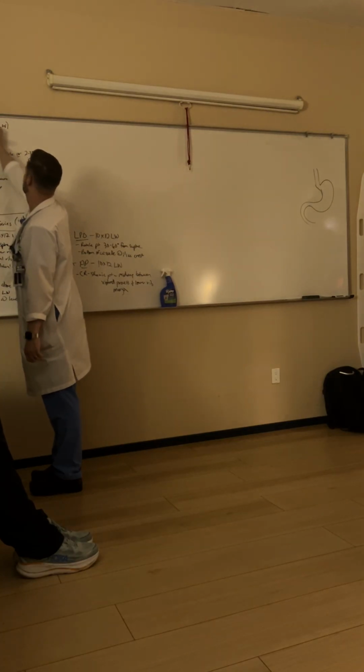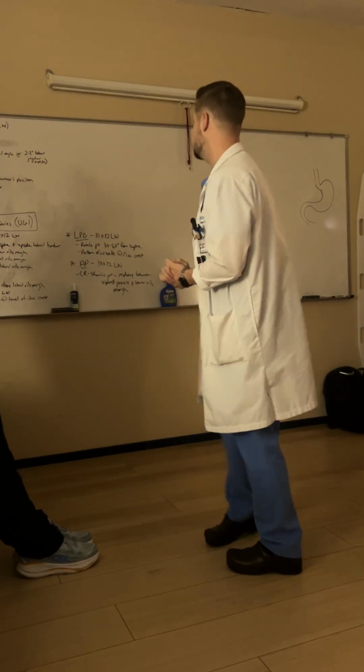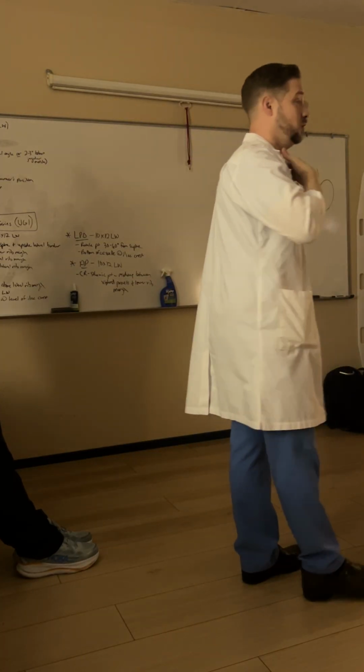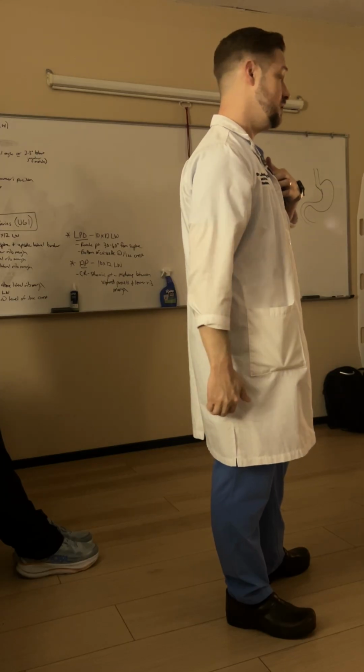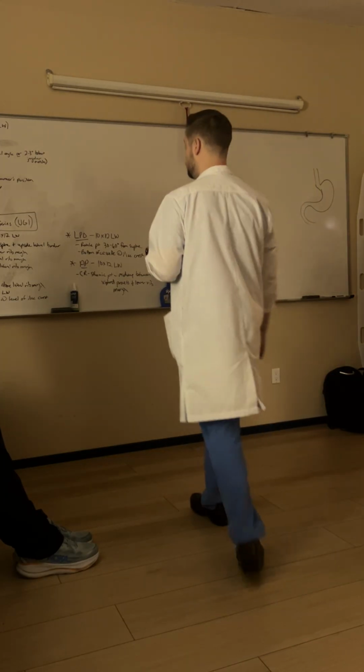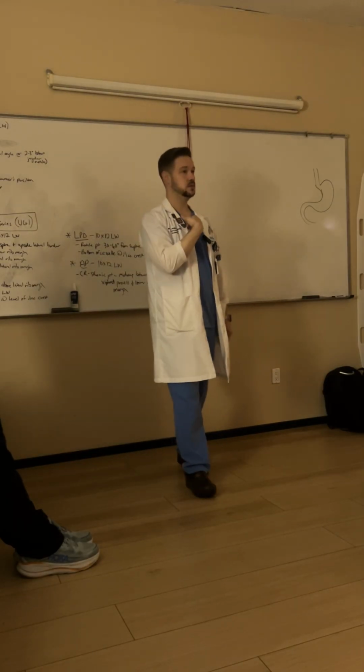We're going to take that off. I hate that. CR is centered to the level of T5 or T6. It is at the sternal angle, or where the manubrium of the sternum meets the body of the sternum. So about right here, okay? Or 2 to 3 inches below the jugular notch, okay?